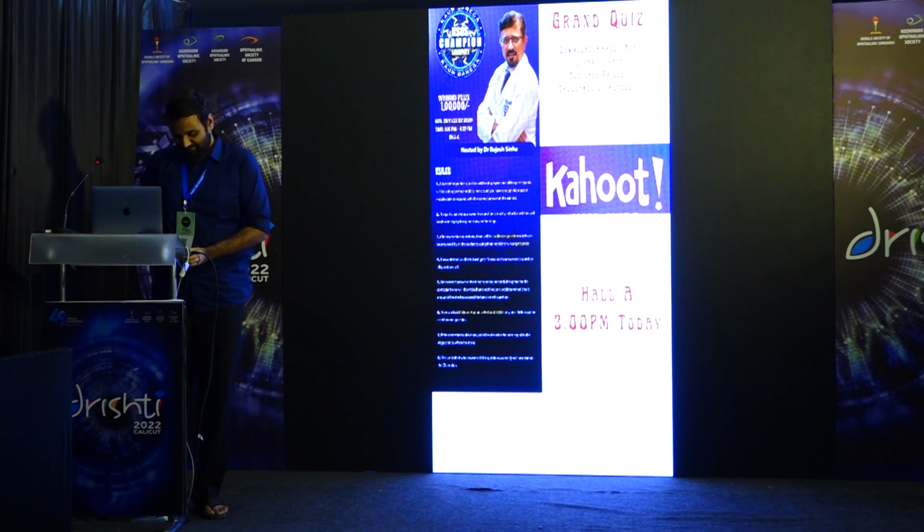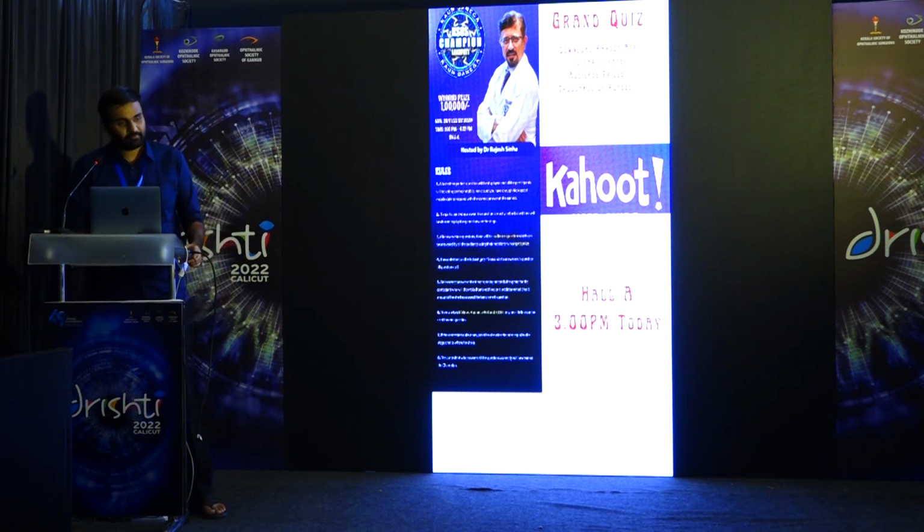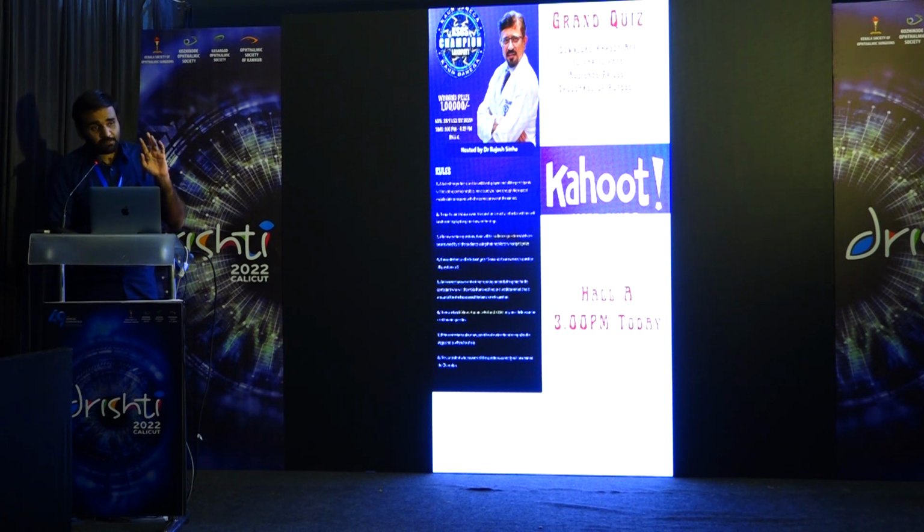Thank you so much. Dr. Sanjeev, one more question. When you use the diamond burr, will it damage more stroma? No, the specialty of the diamond burr is that it will not cut, it will only smoothen. That is the specialty of it. Because like I said, it's just diamond dust.